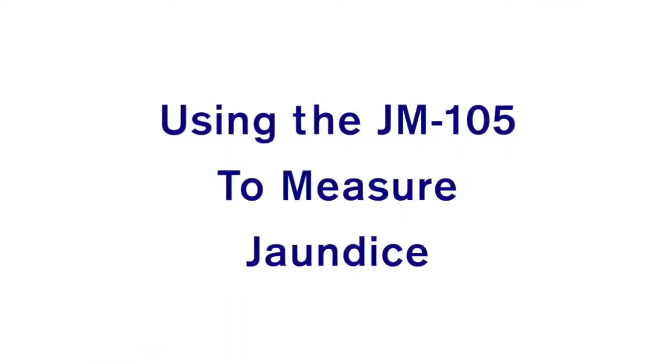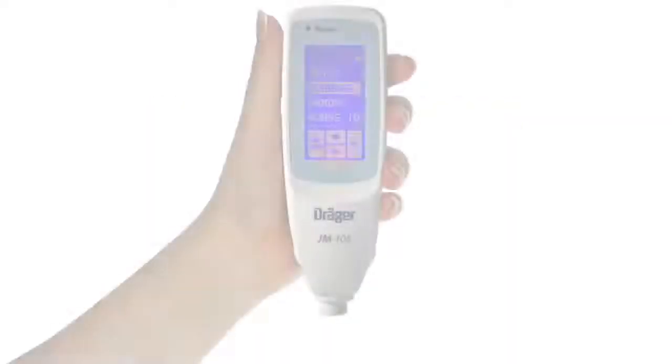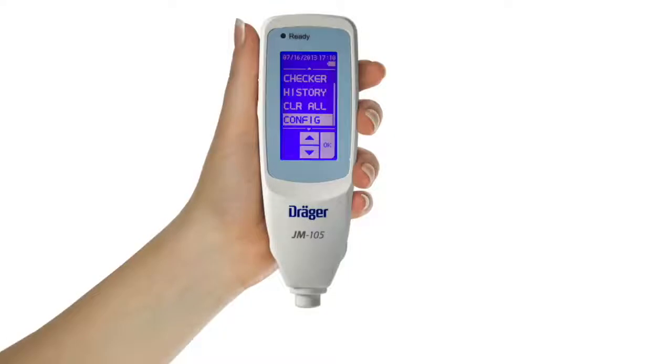We will now demonstrate how to use the JM105 to take a transcutaneous bilirubin measurement on a newborn infant. During this segment, the device will be shown in multiple memory modes: memory off, memory only, link on, in order to incorporate all device features. Changing the memory mode is demonstrated in the configuration segment later in the program.